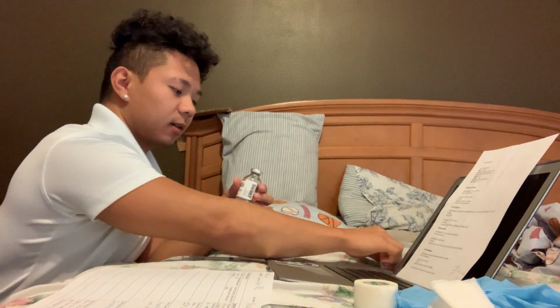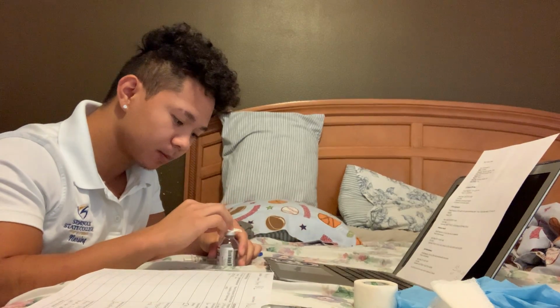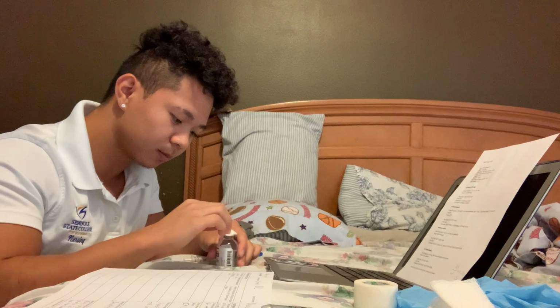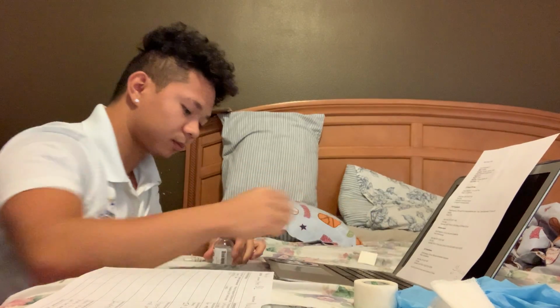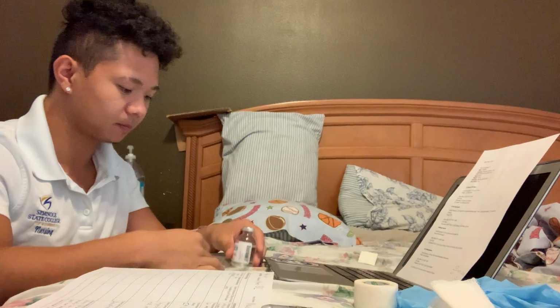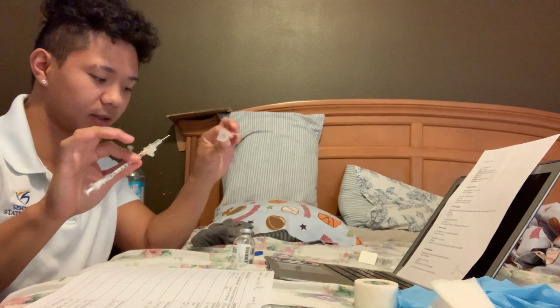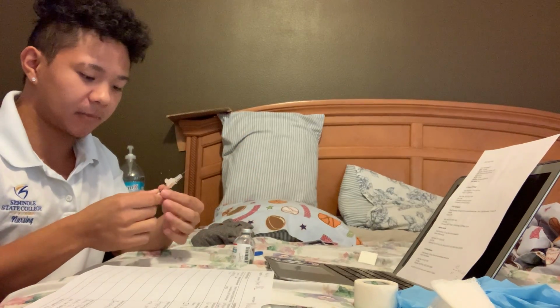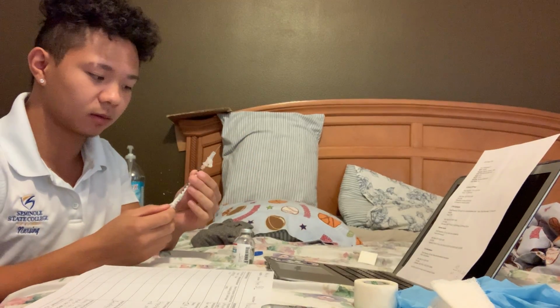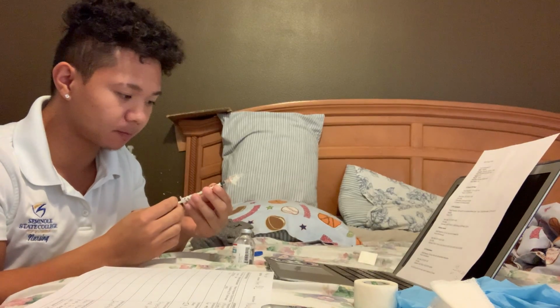And I'm gonna clean the rubber stopper with an alcohol pad. And now I'm going to open the syringe, and I'm gonna withdraw 0.5 milliliters of air.